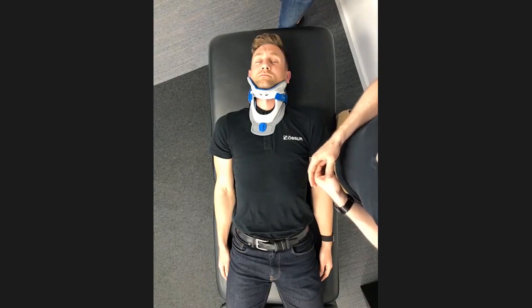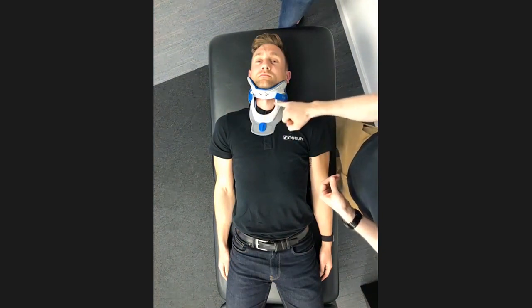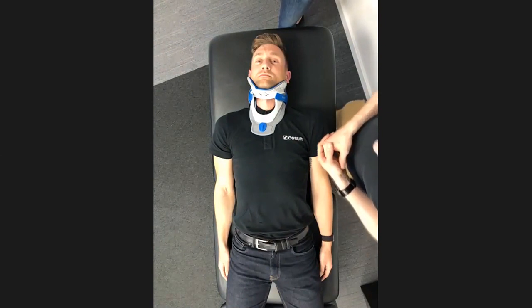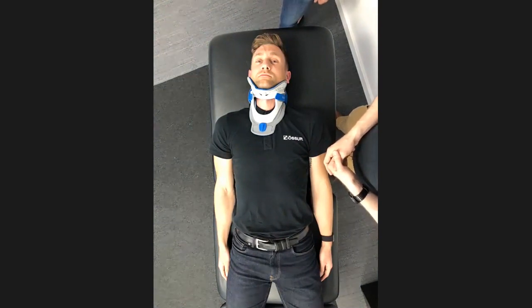Okay. Also, looking at the front, you can see there's a very large tracheal opening, and this just means that if your patient has a tracheotomy, it's very easy, and you may not necessarily need an extension to the tube in order to set that up.